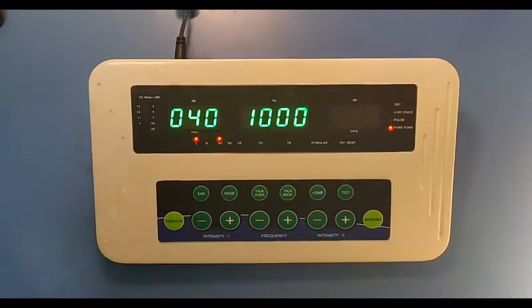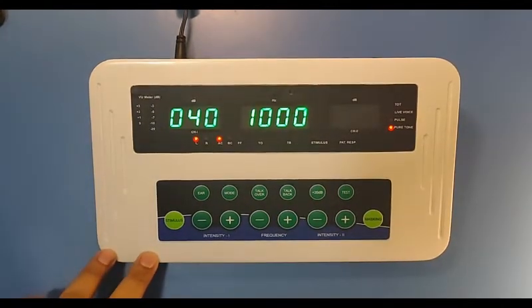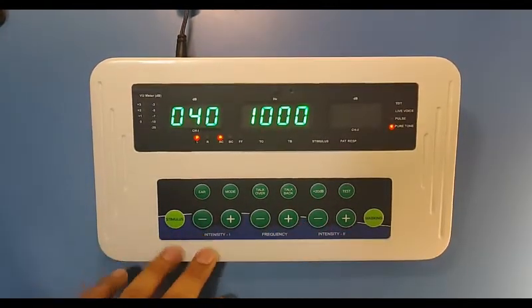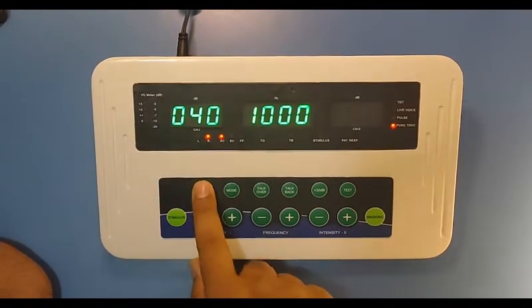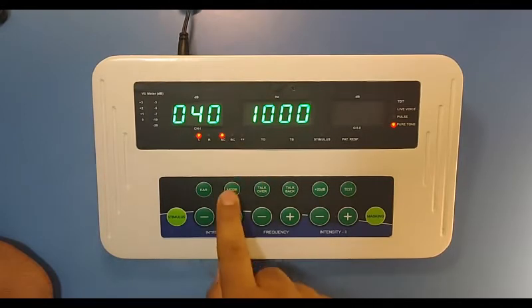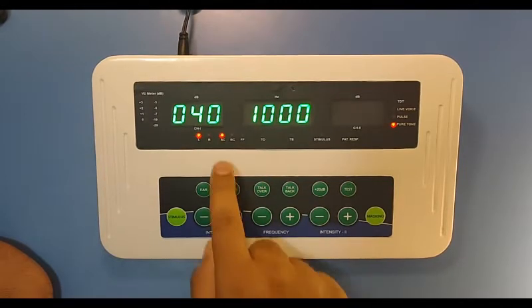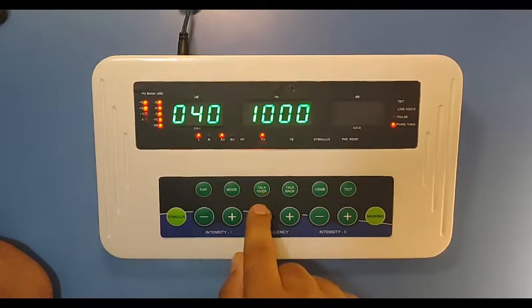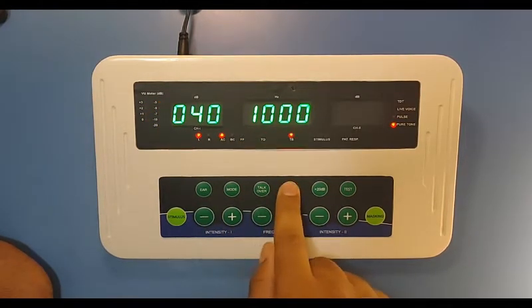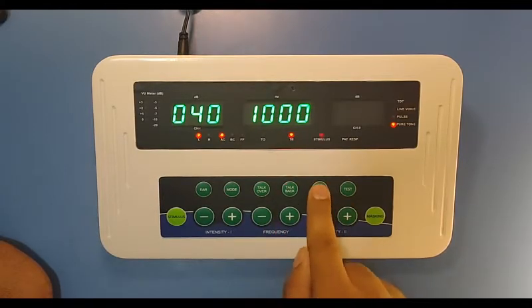Now I will explain the keys of the audiometer. These are the padded keys. From here you will change the channel to left or right. From here you will change the mode of operation like AC, BC, or free field. From here you will turn on the talk over. From here you will press the talk back button to turn it on. From here you will give the stimulus by 20 dB increment.